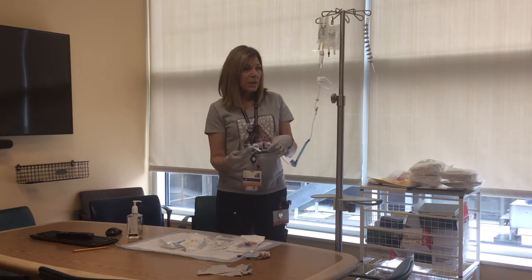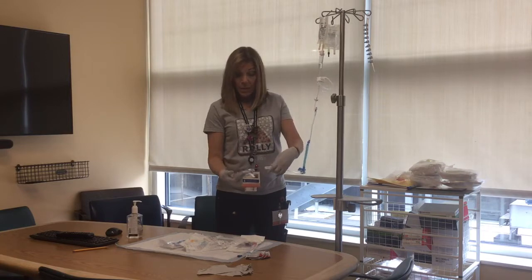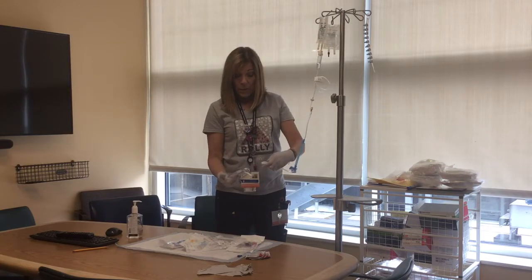You can prime these into a clean container like a french fry container. You just don't want to prime them into the trash can or over the trash can, or the sink where things could be dirty.